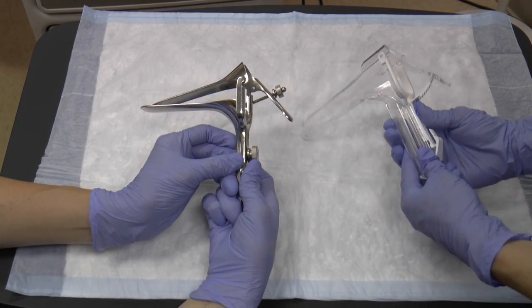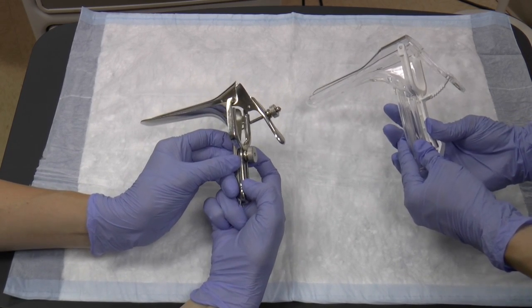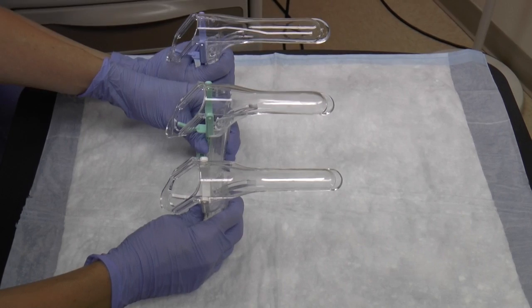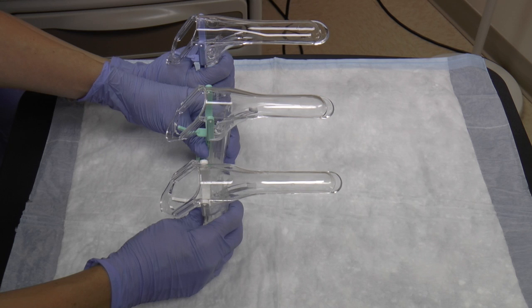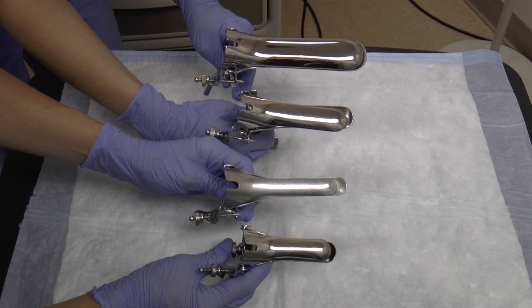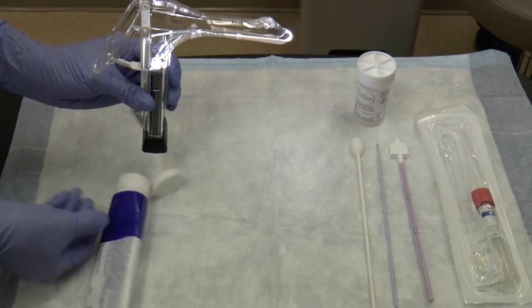We caution you about opening the speculum too wide. If you are having trouble visualizing the cervix, repositioning the speculum is better than opening the blades wider. The speculum exam is the most difficult to master and is the most likely time to cause the patient some discomfort. We recommend practicing the mechanics of the speculum. If you are comfortable with the tool, then the exam will be easier for you and the patient.